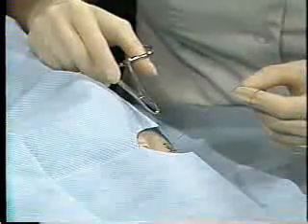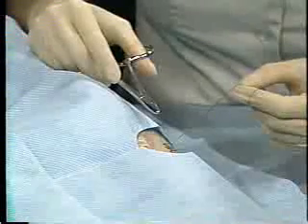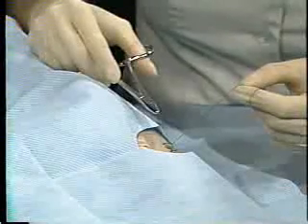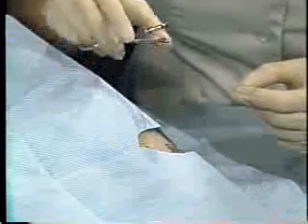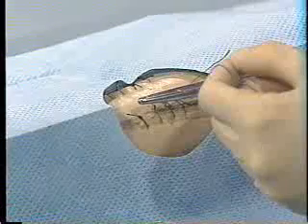The suture forms a V shape, with a long end having the needle and a short end. Hold the long end in one hand and the needle holder in the other. Insert the needle holder into the V. On the first throw, wrap the long end of the suture twice around the instrument toward the short end.